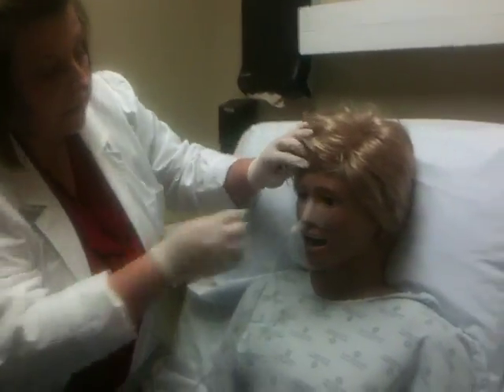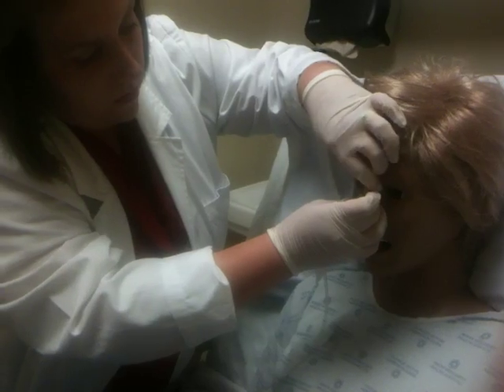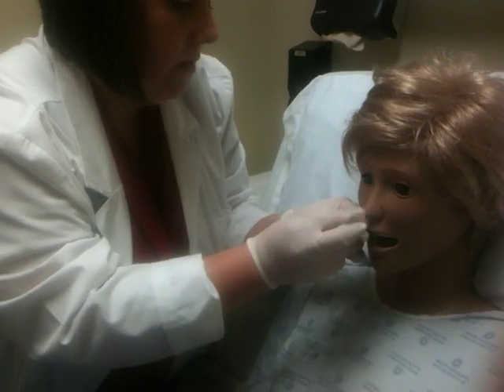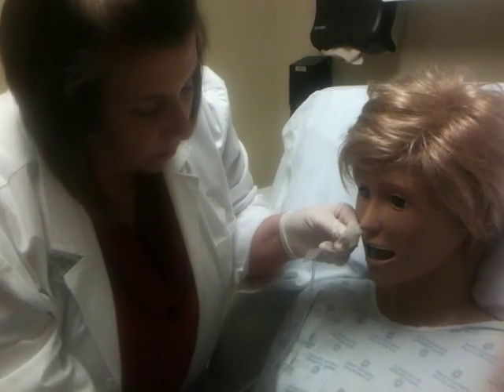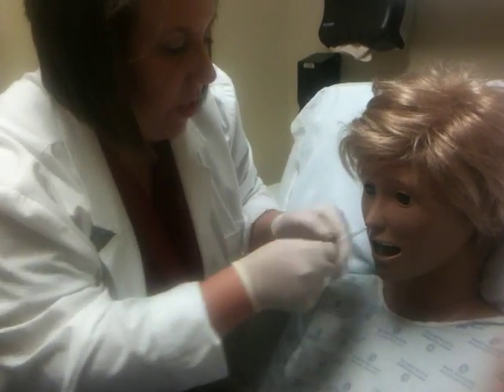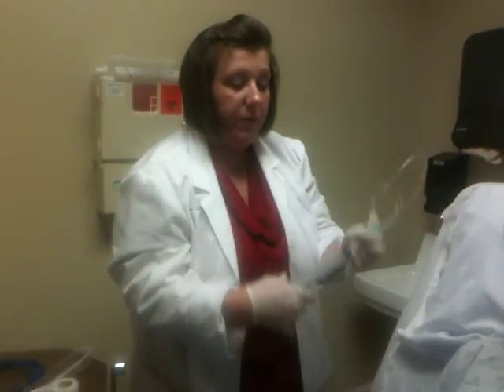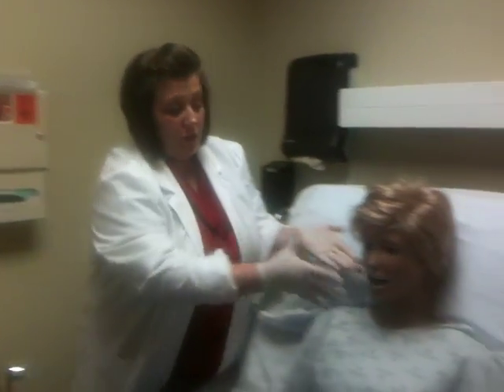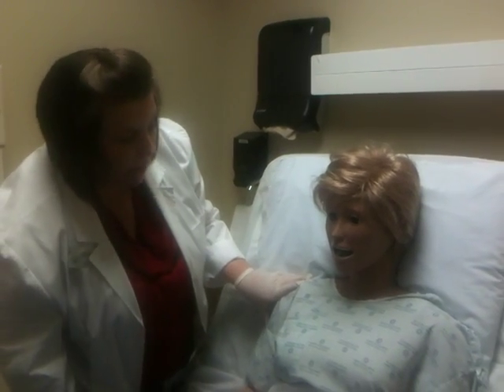Okay? All right, Miss Smith, I'm going to loosen your tape. Sorry. Okay. All right, Miss Smith, when I count to 3, I want you to hold your breath, okay? So 1, 2, 3, hold your breath, and as she's holding her breath, you would remove the tube, okay, and wrap it in your towel, and then you would dispose of this in the biohazardous disposal, okay. She may want you to clean her face up, give her a little bit of oral care. All right, Miss Smith, does that feel better?